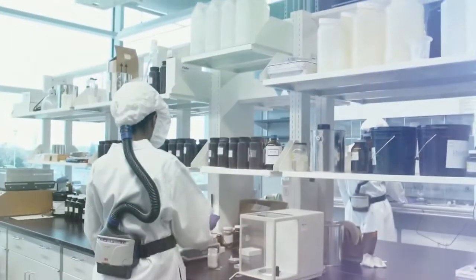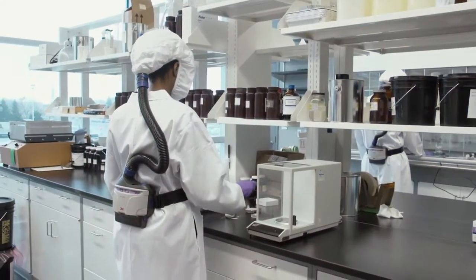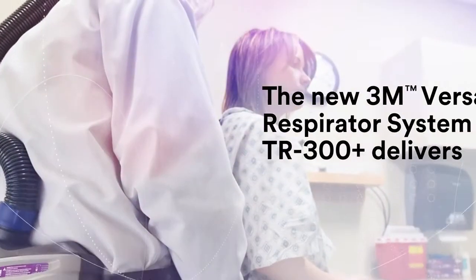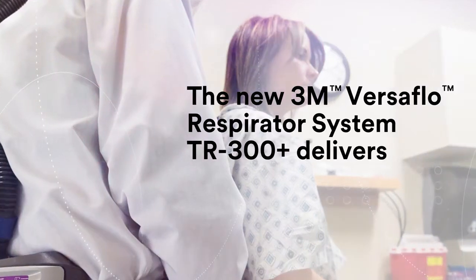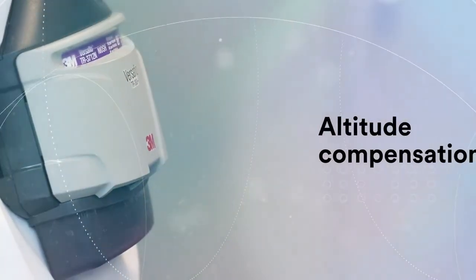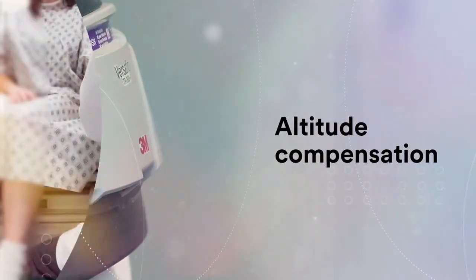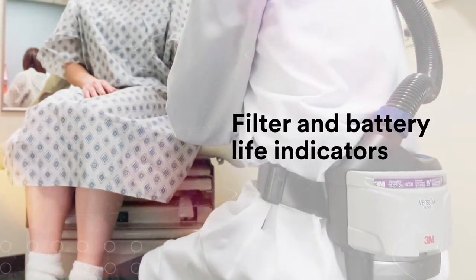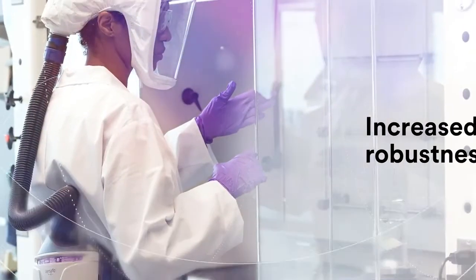The new TR-300 Plus PAPR offers even more features than the TR-300, including two selectable airflow rates, altitude compensation, new filter and battery life indicators, and an overall increased robustness.